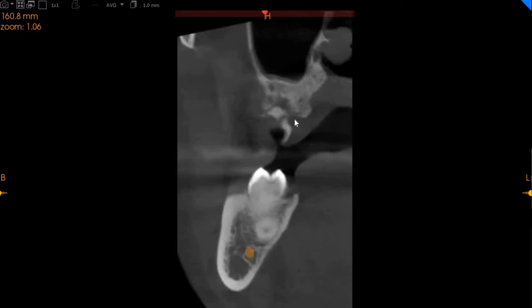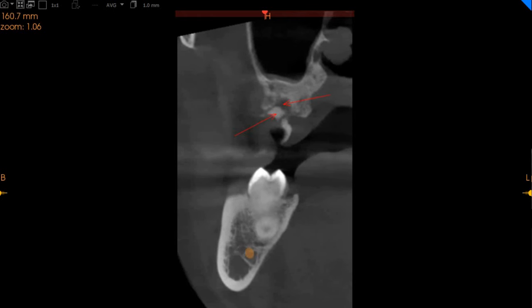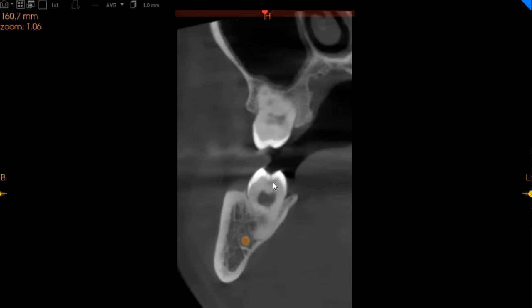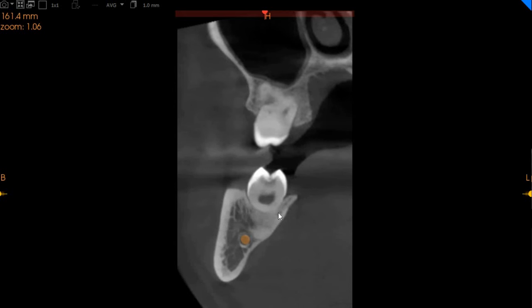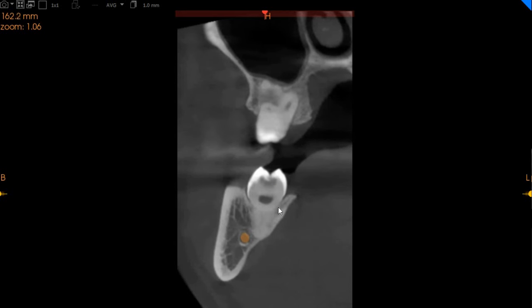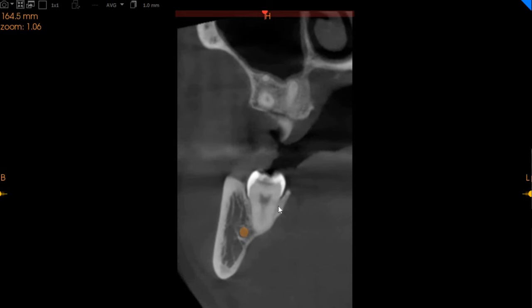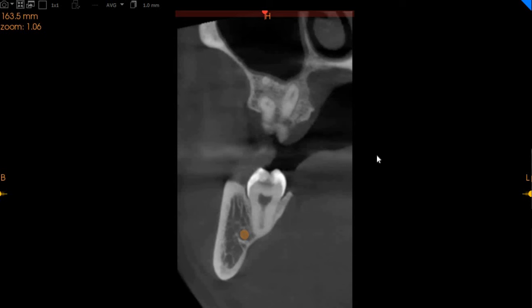Moving to the top left wisdom tooth, you can see periapical radiolucencies and remnants of BDRs in the upper left segment. In the lower left segment, you can see it has a Class 1 carious lesion right here. The mesial root is slightly far away; however, the distal root is more closely associated with the inferior alveolar nerve. It's not as closely associated as on the right side. It may appear as if it is overlapping, but it is actually on the lingual aspect, whereas the nerve is on the buccal aspect.